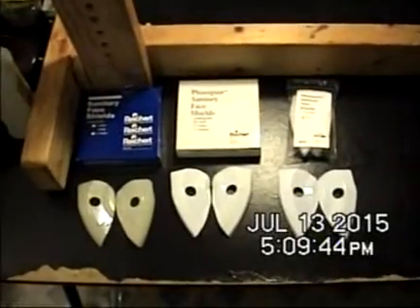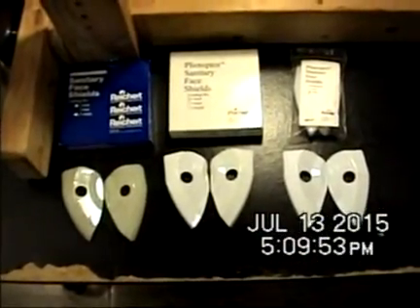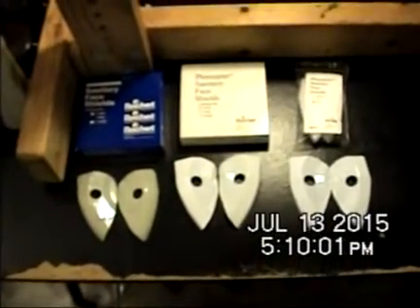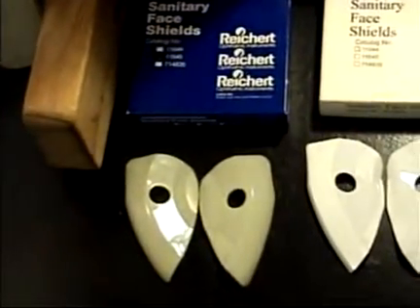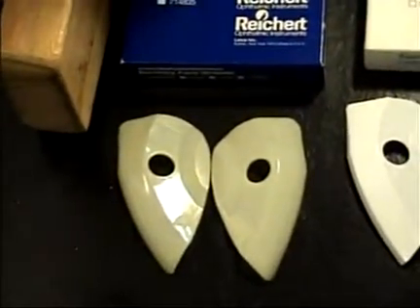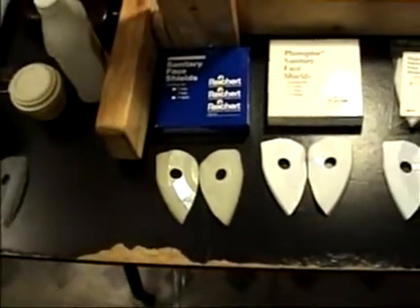This is all about face shields for the Reichert Phoropter. Starting about 18 years ago, the design of the face shields seemed to have changed so that they no longer fit as well. Going back 20 to 30 years ago, face shields were very similar looking but performed much differently — they would stay in place while doing an eye exam on patients and sit securely on the Phoropter.